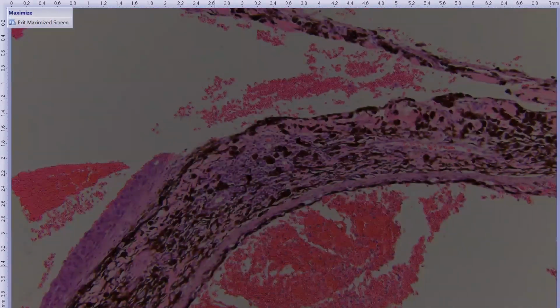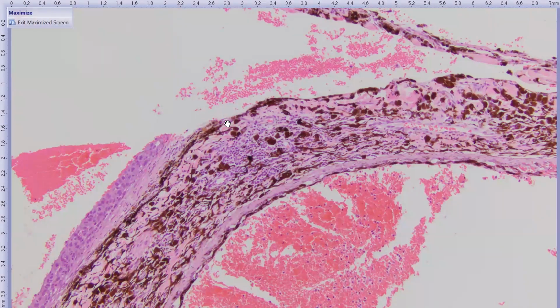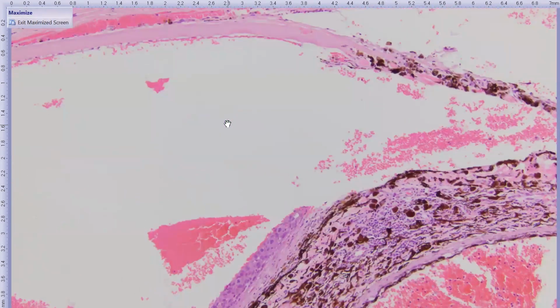And over here in the iridocorneal angle, these are definitely neoplastic cells here. And more than likely, they had spanned the iridocorneal angle and were causing peripheral anterior synechia. But I think it's a little bit artifactually separated here. There's also a little bit of lymphoplasmacytic inflammatory infiltrate in the iris stroma, which is relatively mild.